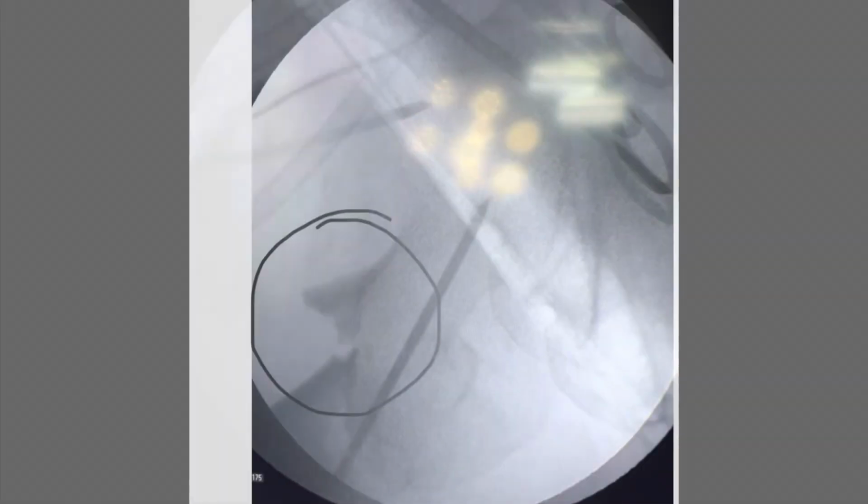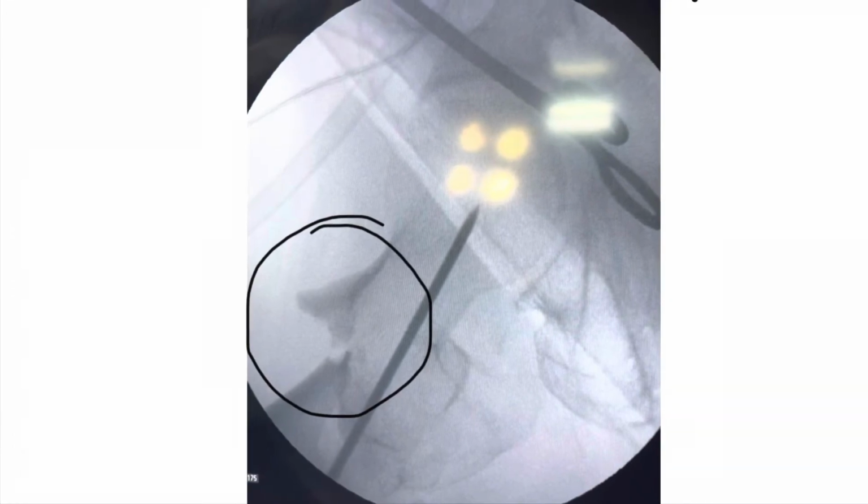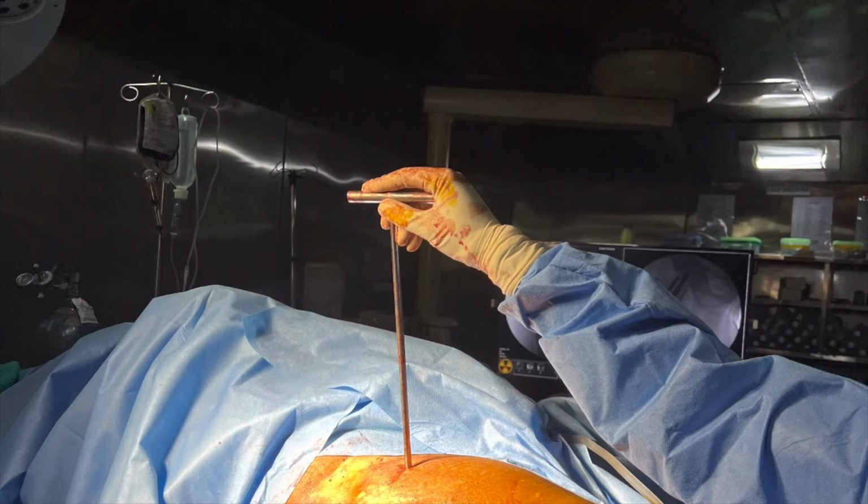This was partially successful as the bone was osteoporotic and there may be psoas obstruction. Second, using a blunt instrument such as a 6.5 mm screwdriver introduced in an anteroposterior direction to the anterior aspect to press down upon the anteromedial aspect of the externally rotated proximal neck fragment.